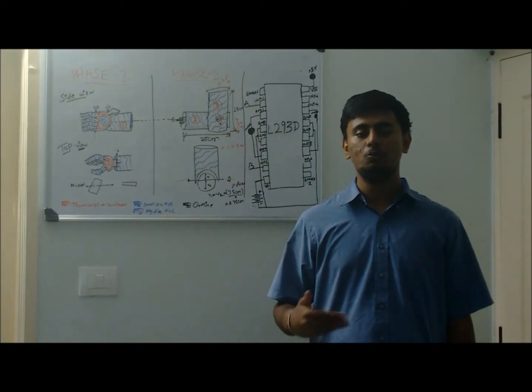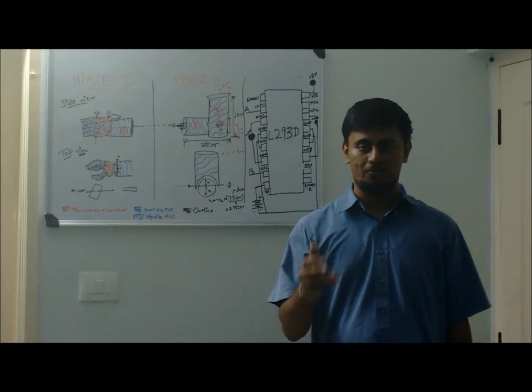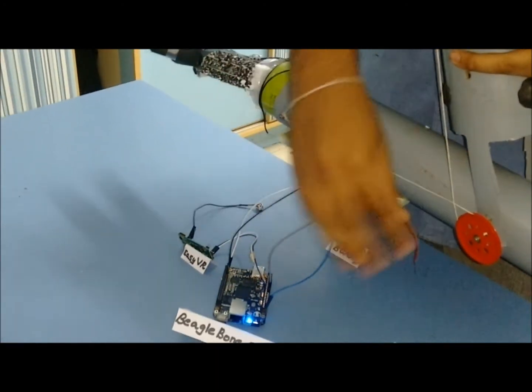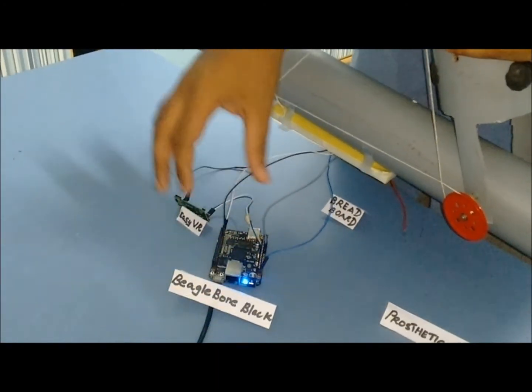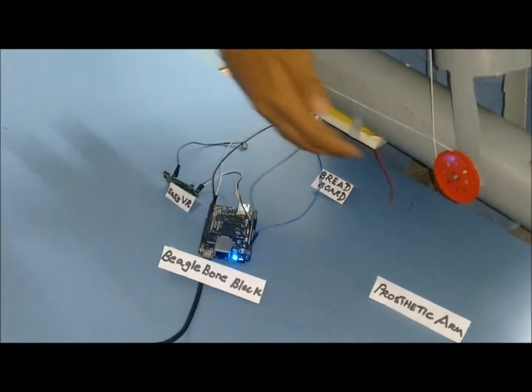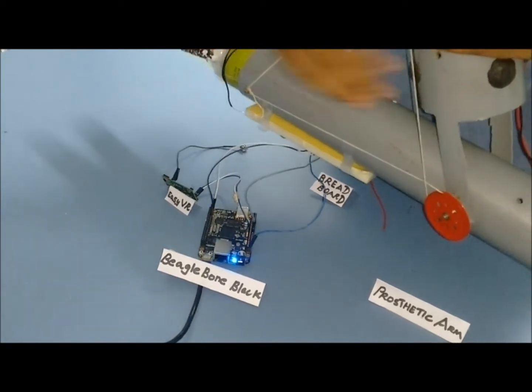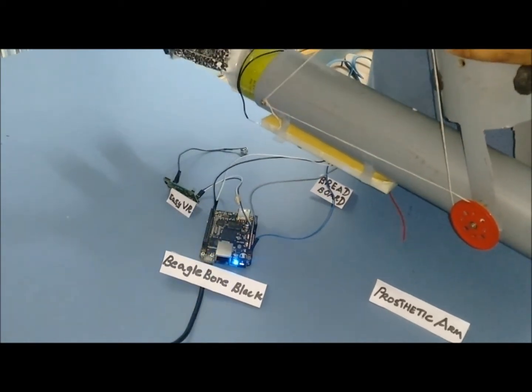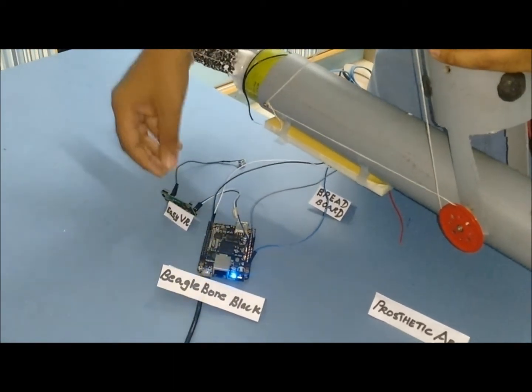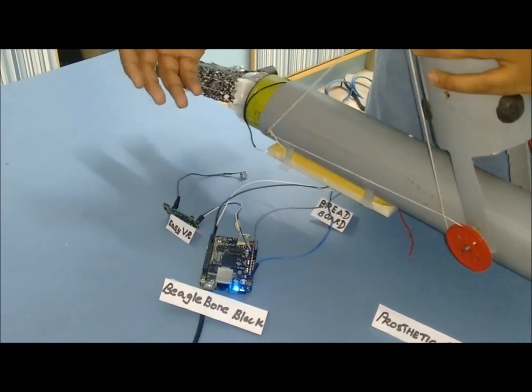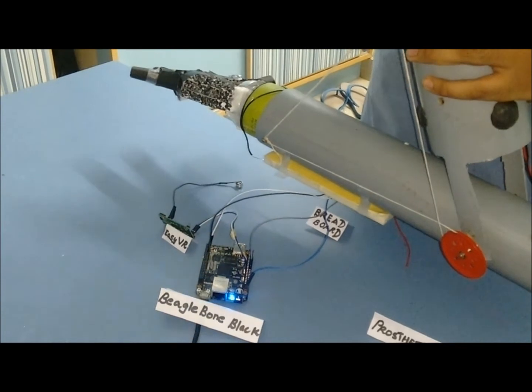So let's move to the working principle of this. As you can see here, these are the main TI components. Firstly is the beagle bone black. The L293D connected here on a breadboard as you can see here. And then next this is the prosthetic arm setup. Now we have also used an additional module that is the EZVR for the voice recognition. So how does this work? Let me first explain its working.